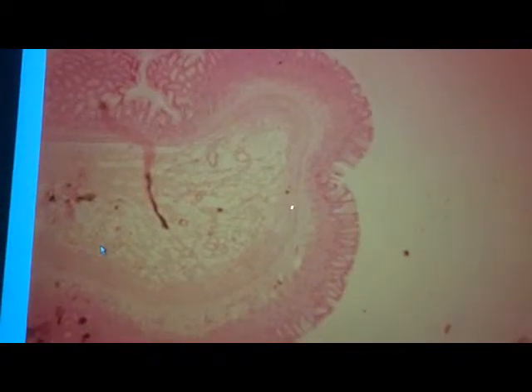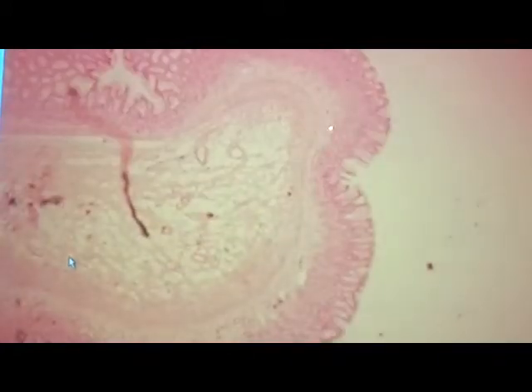I mean, I could use this magnification. You just have to know by geometry or geography where it is. The pits are more up top. The muscularis mucosa here is this tissue. If this is muscularis mucosa, what is that? Lamina propria. This is submucosa. I mean, this whole thing is folded, a big fold of rugae. Okay.